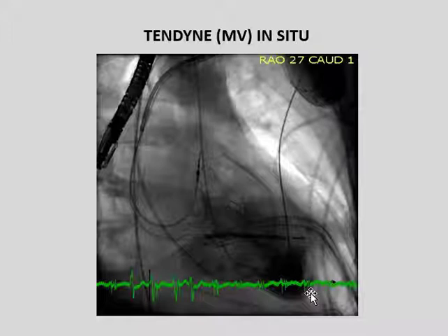So the anaesthetists have first to anaesthetize the patient, the surgeons then do a mini thoracotomy, make an incision in the apex of the ventricle, and through there, the valve is deployed and anchored around the mitral ring, and then it is actually held in place by little tethers that are anchored to a little strut device, a little prop, a little prosthetic ring or oval that is located at the apex, at the site of that incision that allows the procedure to happen.